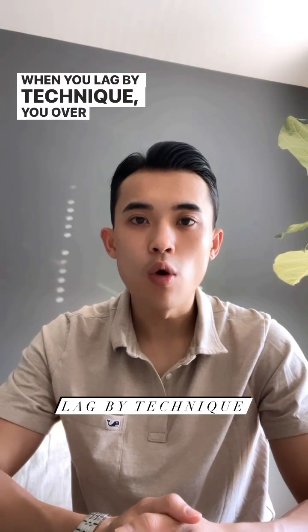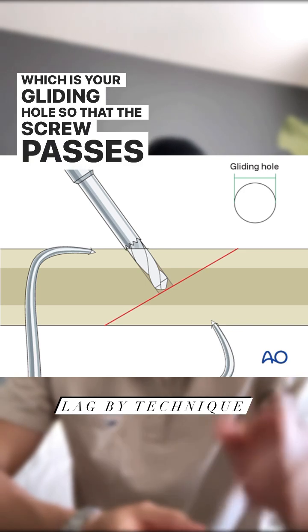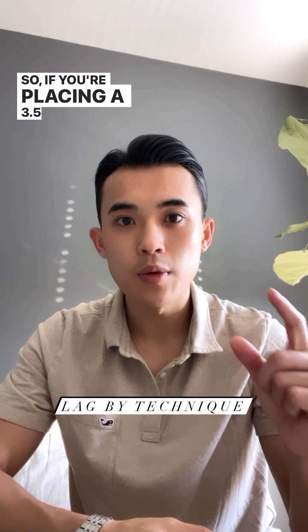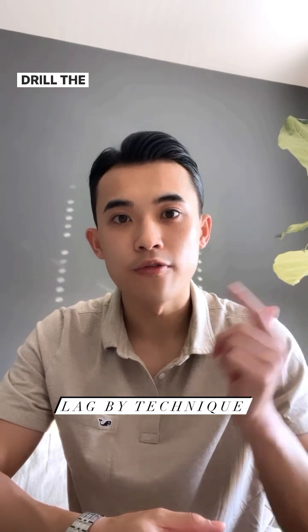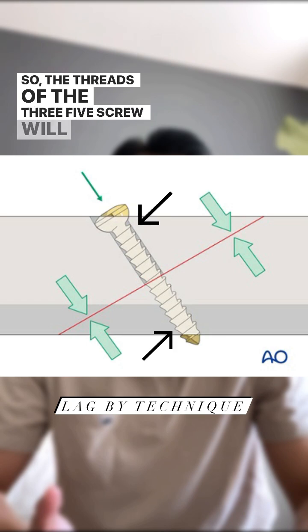When you lag by technique, you over-drill the near cortex, which is your gliding hole, so that the screw passes right through and only engages with the far cortex. For example, if you're placing a 3.5mm screw, you drill the near cortex at 3.5mm, then switch drill bits and drill the far cortex at 2.5mm, so the threads of the 3.5mm screw will only bite the far cortex and allow for compression.